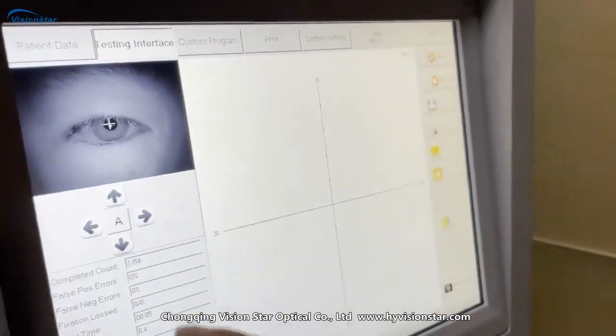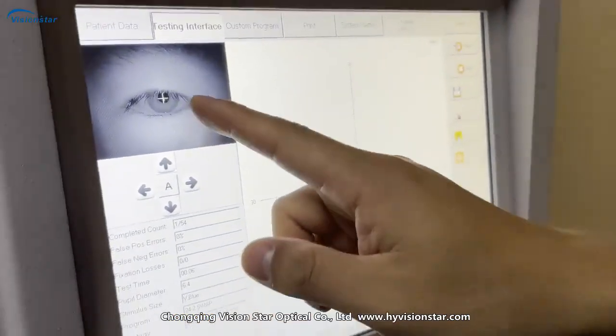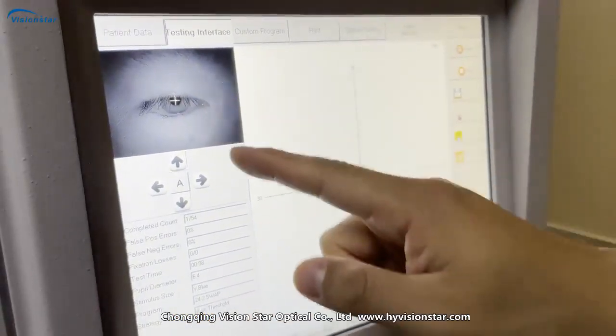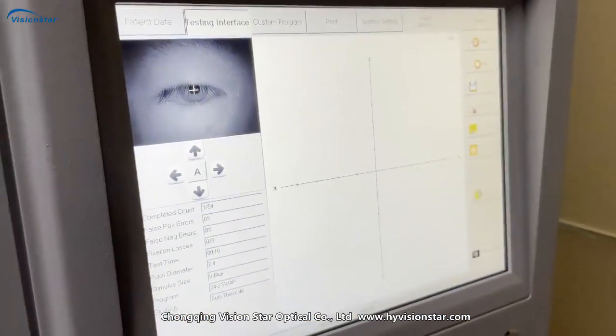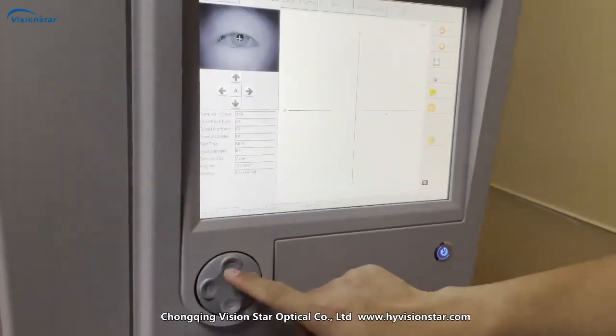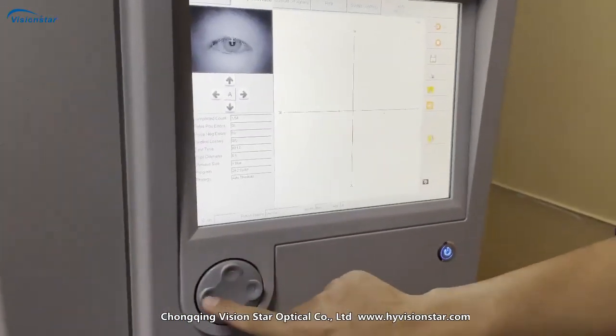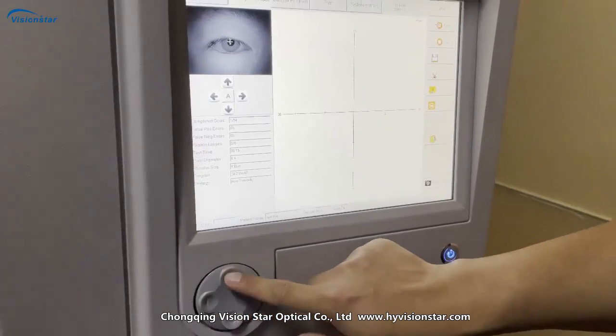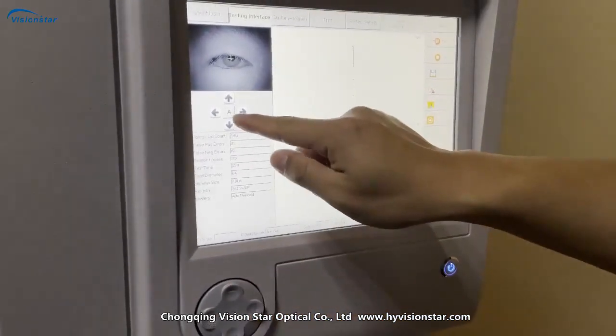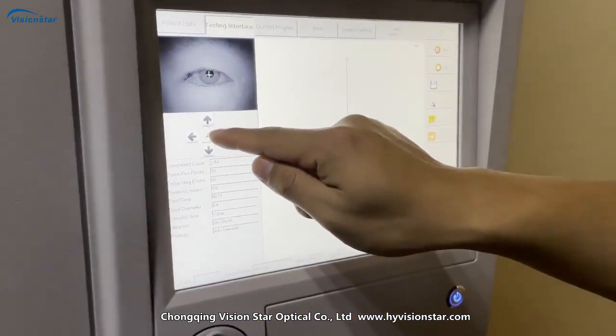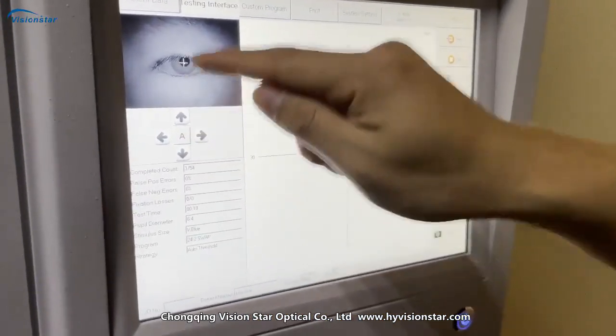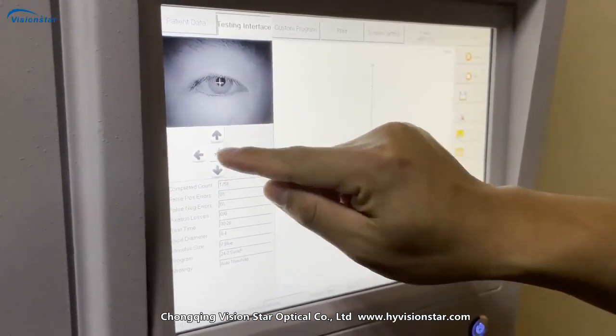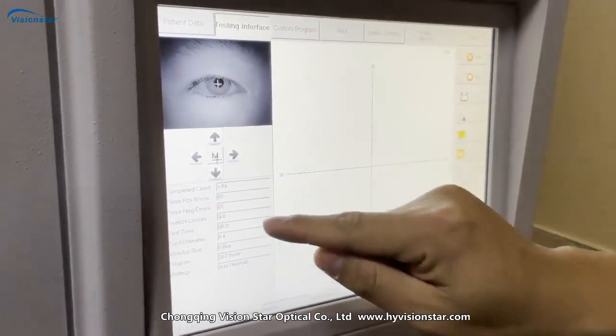Okay, if the eye position is not correct, you can adjust the position from this part. And if you choose A model, A means automatically adjust, and it also has menu model.